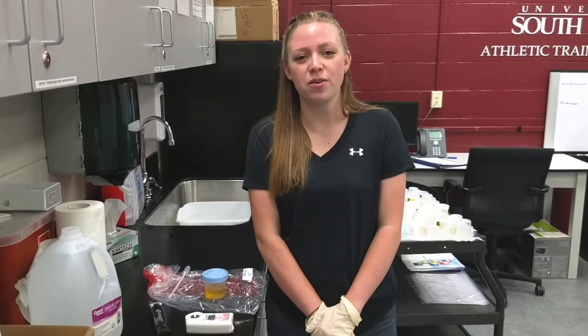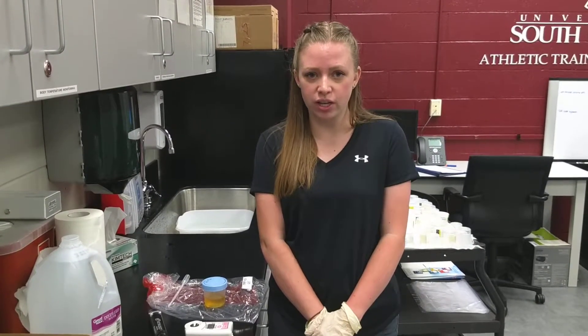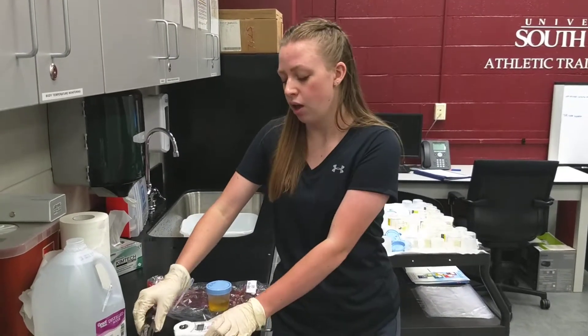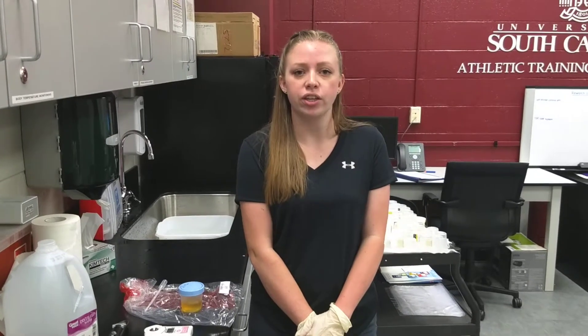Hi, I'm Caroline Taylor and I'm in the undergraduate athletic training program at the University of South Carolina. Today I will be showing you how to use two different types of refractometers, a digital and a manual. A refractometer is an instrument that assesses the patient's hydration levels by measuring the specific gravity of their urine.